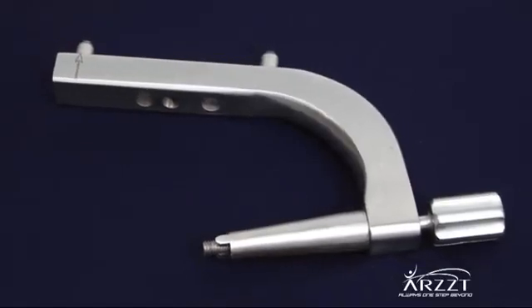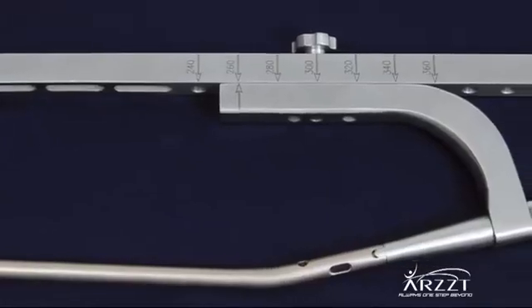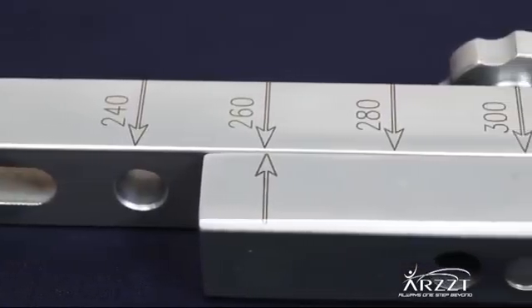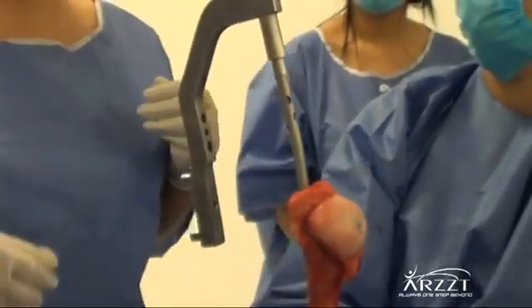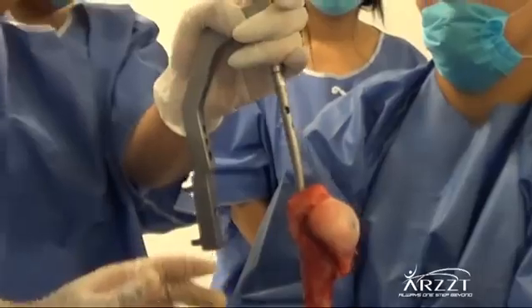The nail should be assembled and calibrated prior to use inside the humerus to corroborate the free passage of the screws and the exact symmetry with the instrument frame. Inserted firmly following the humeral shaft, guided by the image intensifier, making sure that a false via has not been performed.